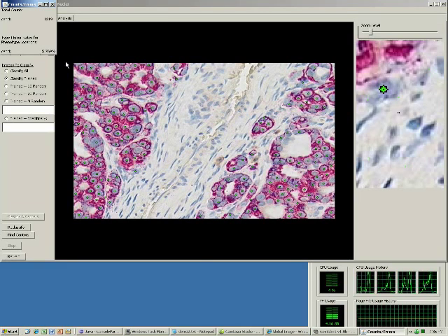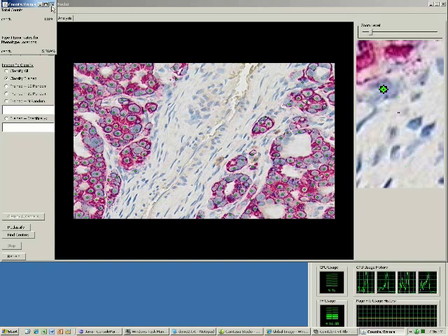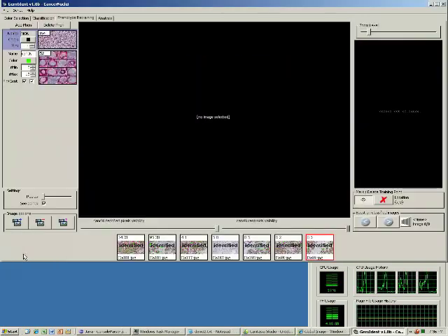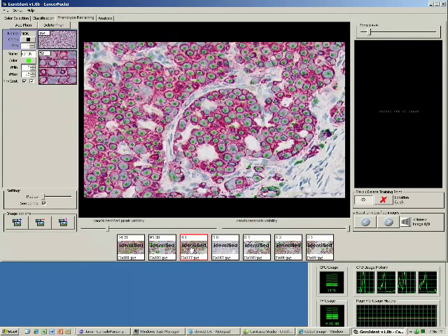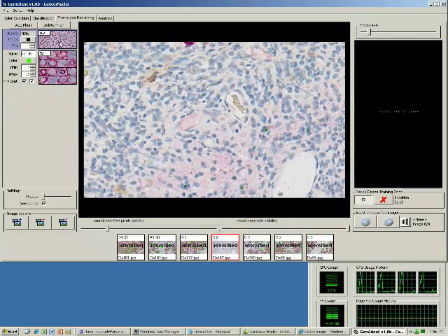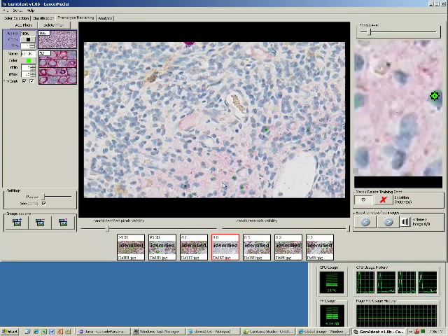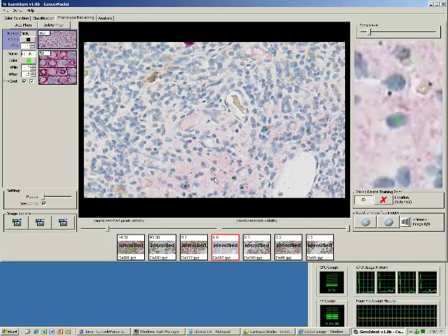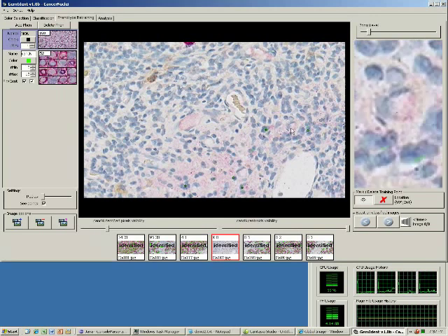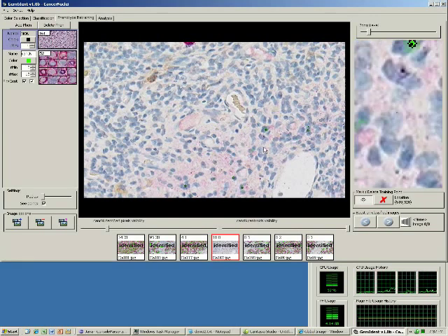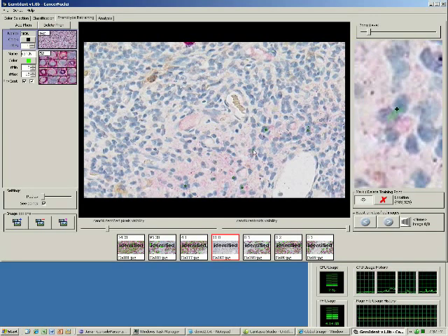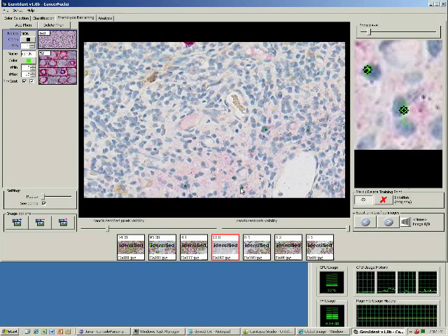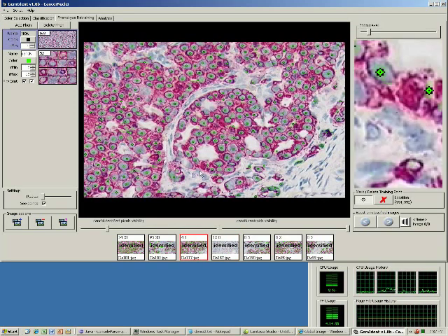To make the identification even more solid, let's return to phenotype training. Here are some errors. You get the idea.